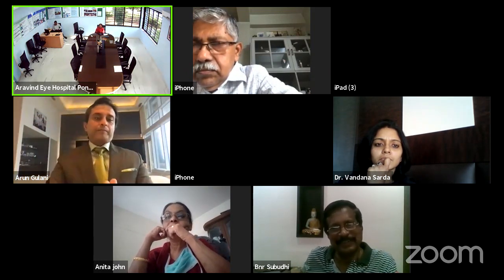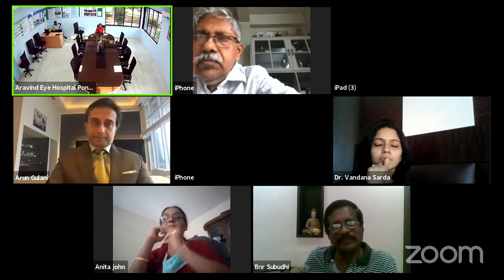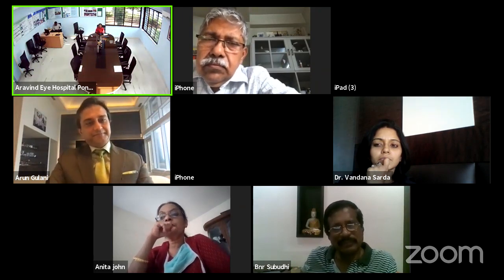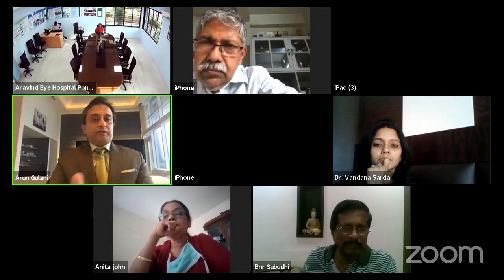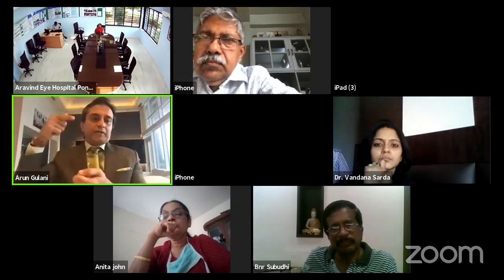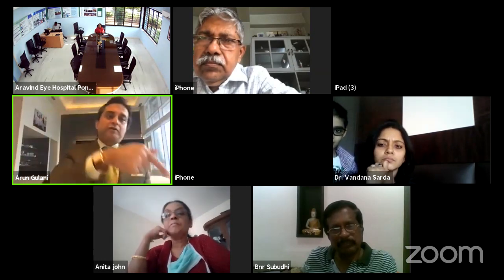Okay. So one point to note is to avoid excessive cautery, because we tend to see a lot of bleeding during our pterygium surgeries. So do you follow any specific medications, topical medications, pre-operatively? Yes, please. I should have mentioned that in the surgery. I do use a Vexel. When I removed the pterygium, you saw me take a Vexel, which is dipped in epinephrine, and I put it straight into the medial angle.